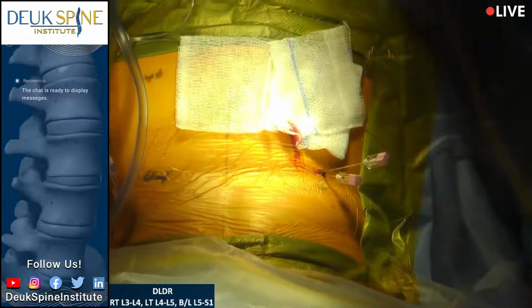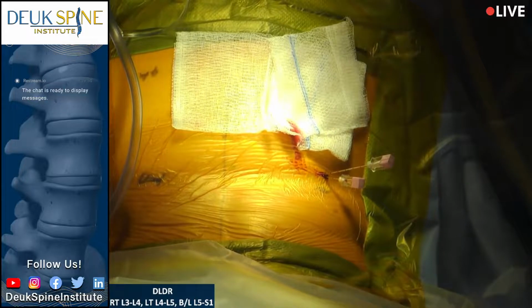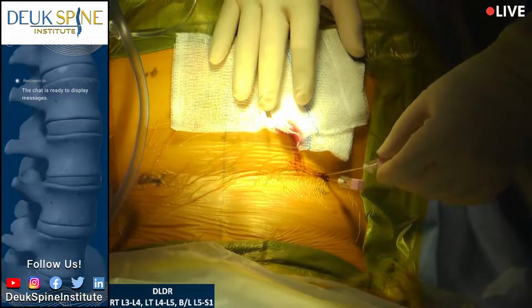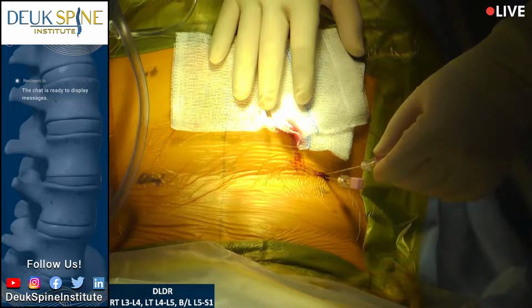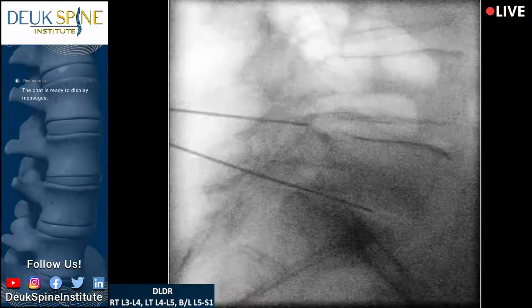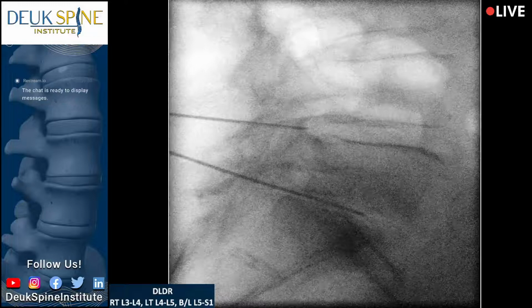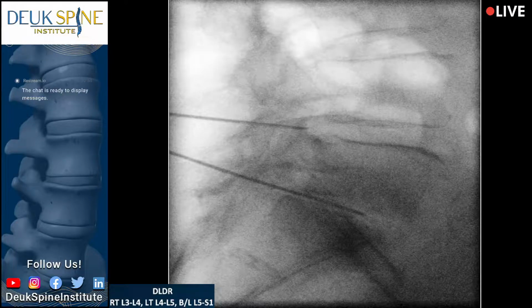You all right? Yeah. Well, we're close to where the pain is coming from. So, shot. Yeah. You okay? You having pain in your back? That's where your bad disc is. So, we're just passing her facet. And her herniation here is good size. Is that better? All right. You're doing great, by the way. I know it's hard to believe it, but you're doing really good.